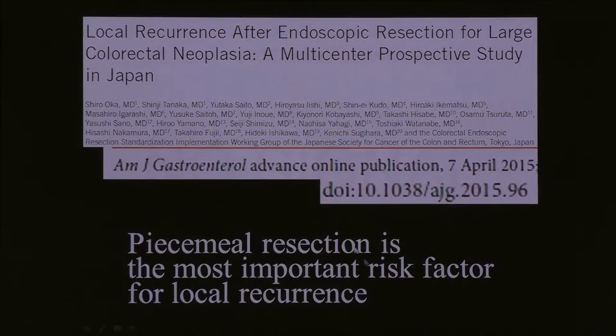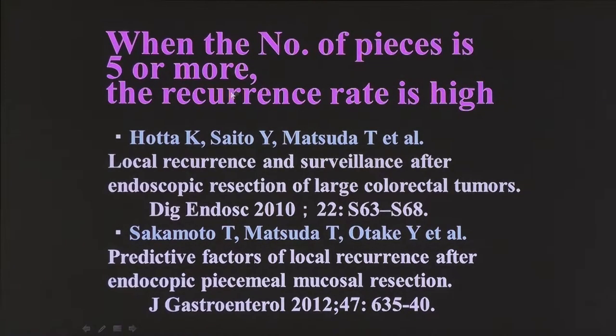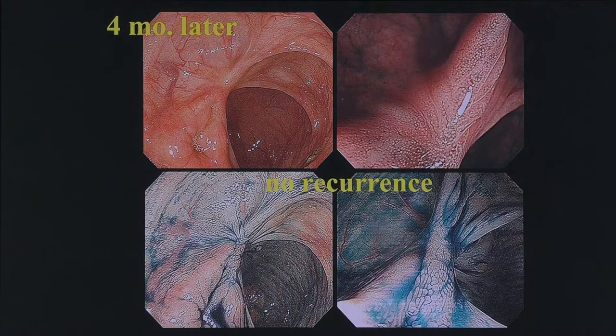But you must be careful because piecemeal resection is the most important risk factor for local recurrence. Some literature says that when the number of pieces is 5 or more, the recurrence rate is very high. But in this case, I followed up the patient 4 months later. Luckily enough, there was no recurrence.